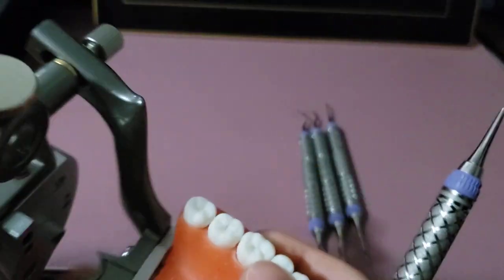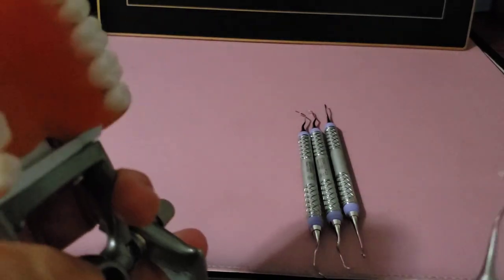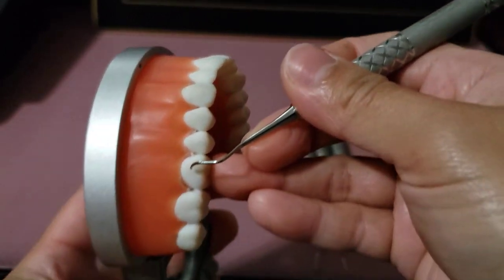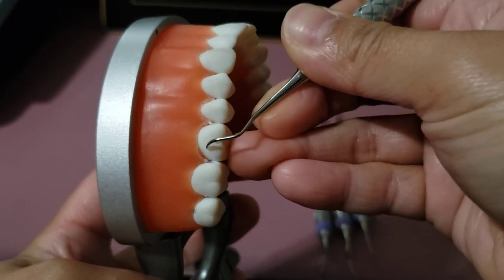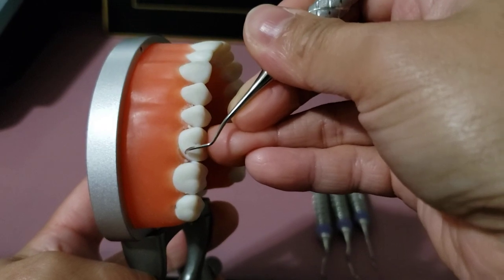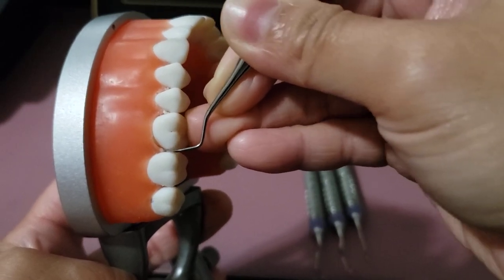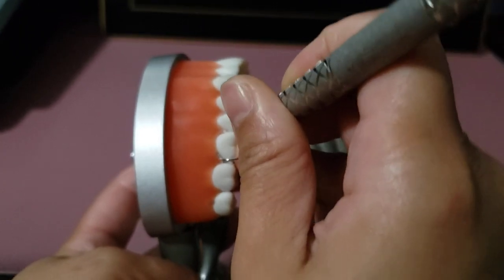For maxillary teeth, you would always fulcrum on the same tooth, specifically on the cusp, with the palm facing towards you. Close, insert, open away to activate the instrument in the proximal, then point mesially, close, insert, open away, and work until fully in the proximal.